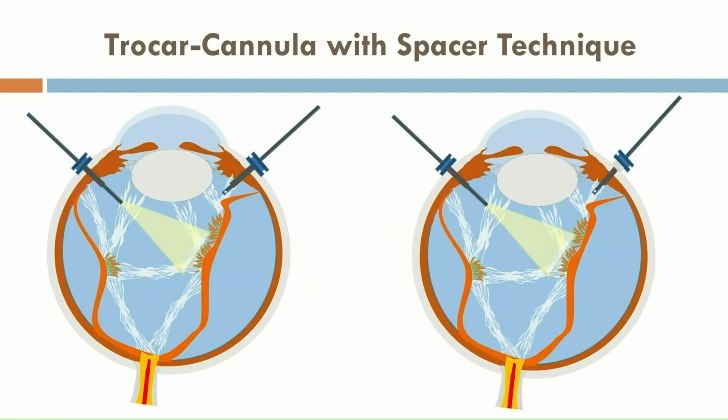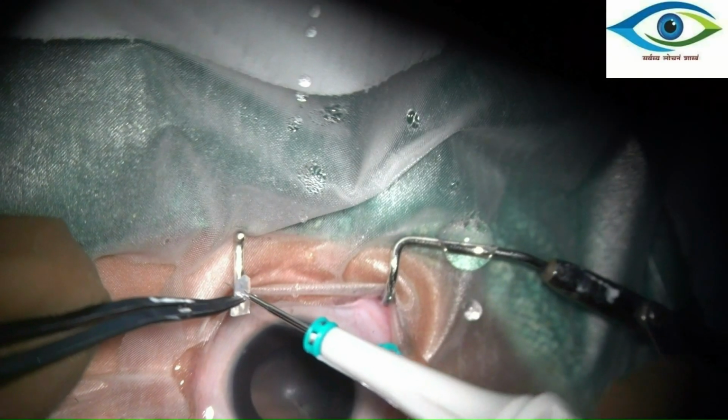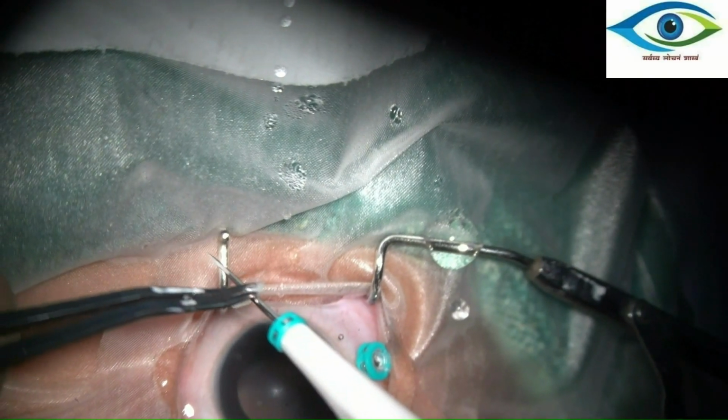Other advantages of this technique include reduced risk of lens injury and easier cutting of the anterior vitreous due to the shorter length of cannula in the eye. This short clip shows the spacer technique of trocar cannula entry.